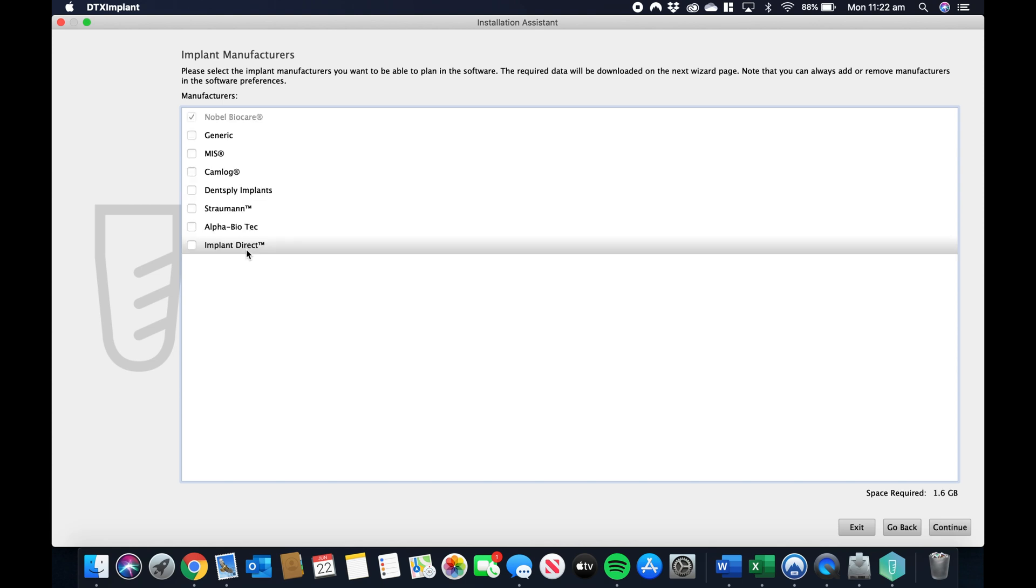This is a really long download process, so I've cut it out in the post edit. But once this is done, the software is going to start again.